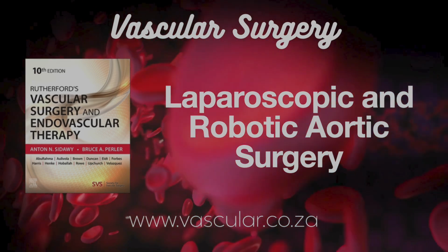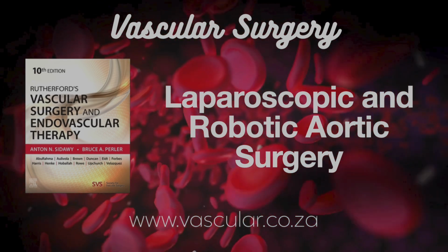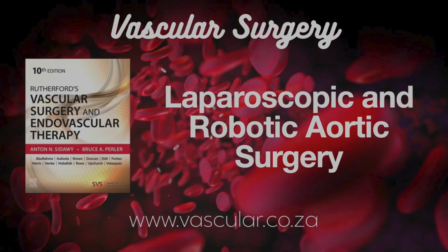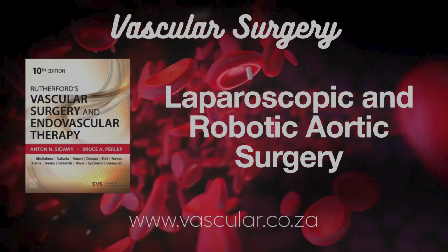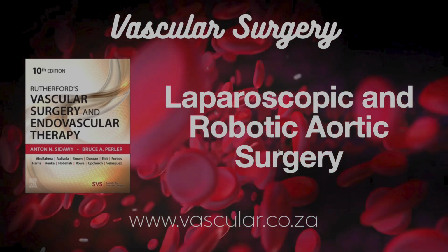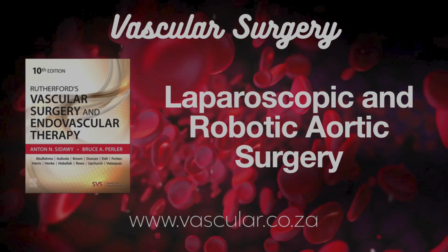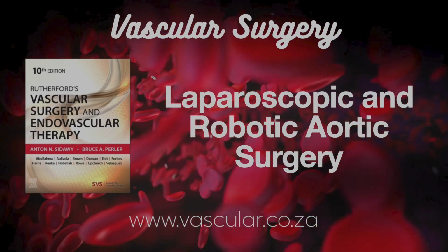Interestingly, average blood loss seems pretty comparable to open surgery in many studies, although they mention extremes can happen, especially with really calcified aortas. Okay. There was also that small trial suggesting HALS might be less invasive for younger sexually active men, not suitable for EVAR, endovascular repair. So specific patient groups might benefit more. Mm. What about that RICO study you mentioned earlier?